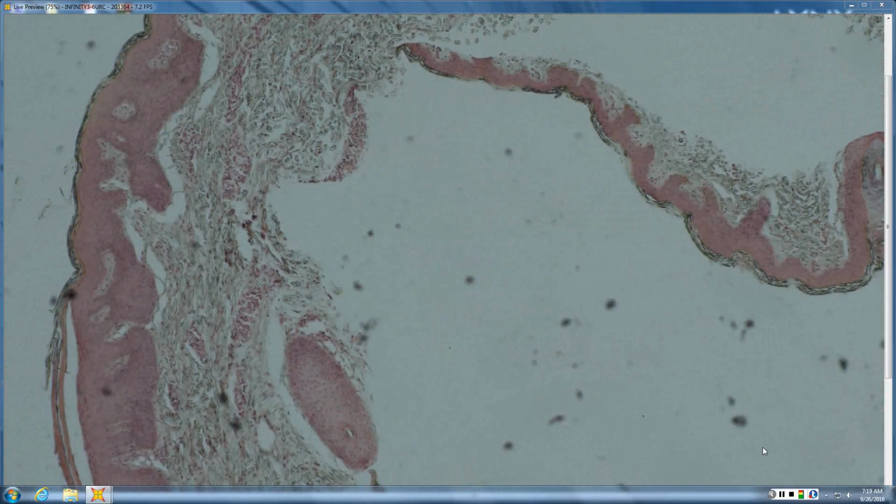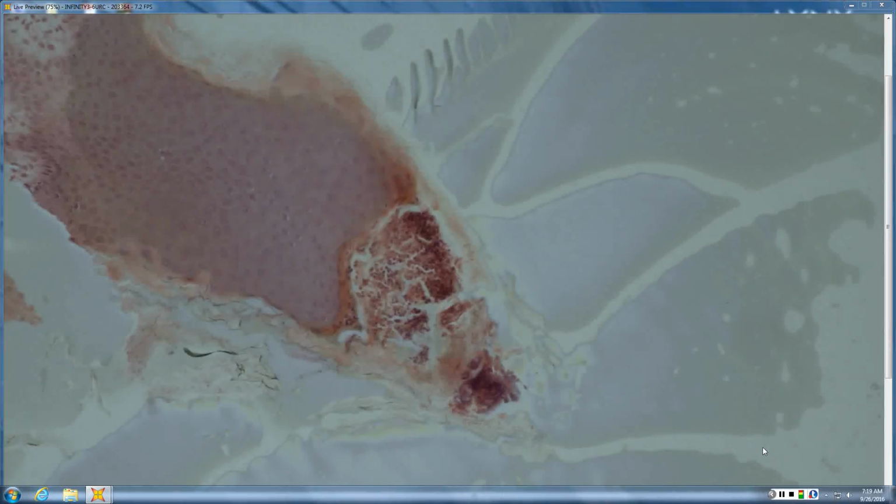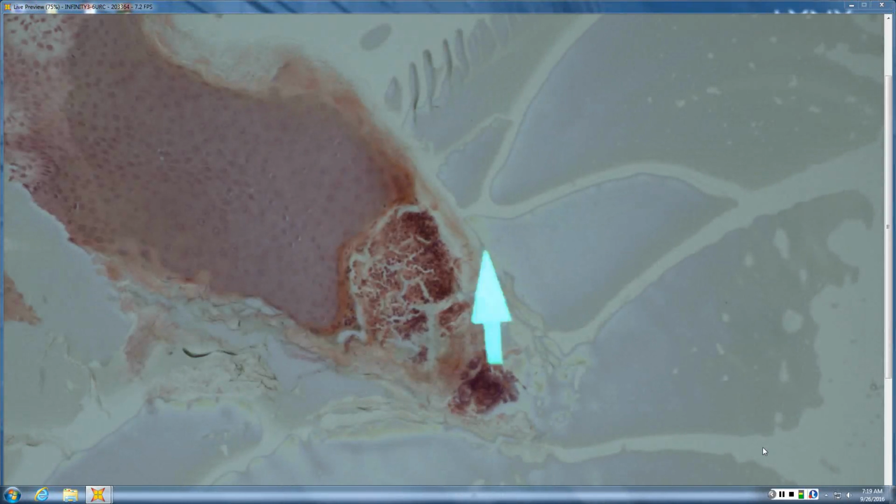Oh, this one's candidiasis. I'll just briefly go through this one. The point here is that somewhere on one of these cuts, way down here where the glass slide isn't that great, there's an itty-bitty tiny little subcorneal pustule, and I think somewhere over here as well. But it brings up a differential. So this is a subcorneal pustule. That's why PITRICS. The C is candidiasis.